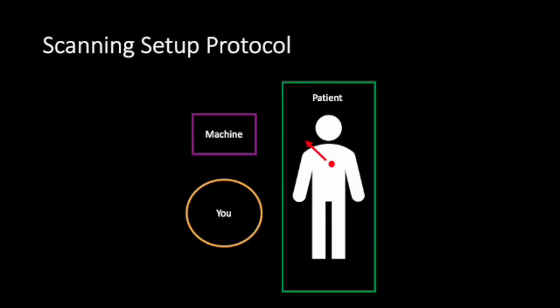Whenever possible, remember that the convention in ultrasound is to have the machine and its operator positioned on the right side of the patient. The patient should be in the supine or semi-recumbent position with their precordium exposed and appropriately draped for privacy. Before placing the ultrasound probe on the patient, examine the patient using standard exam techniques, including auscultation and palpation of the precordium for the point of maximal impulse, thrills, and heaves. Also, take note of the patient's neck vessels and assess their JVD.